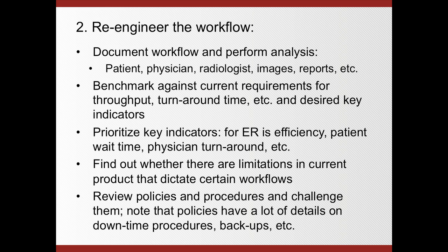Now, by using a PACS system or the RIS system for several years, you gained a lot of experience and you know much better what the capabilities and opportunities are in re-engineering the workflow. Now, it's also a little bit dangerous because some systems prescribe a certain workflow, and you think that is the only way that you can do certain things.